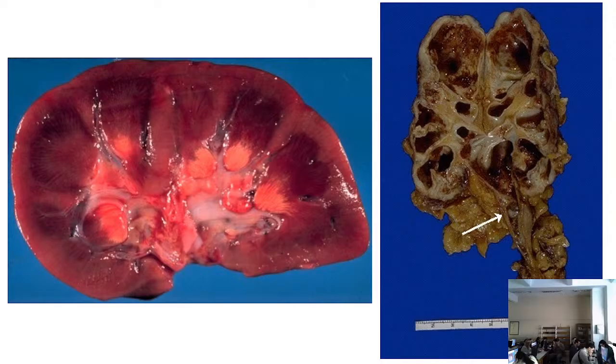This is inflammation. And of course, we can have in our mind that chronic pyelonephritis results from recurrent episodes of acute pyelonephritis. That means infection. But that's not the only mechanism of chronic pyelonephritis. Chronic pyelonephritis on its own predisposes to infection because by definition there is stasis of the urine. However, obstruction is a main factor and reflux is another factor causing chronic pyelonephritis.